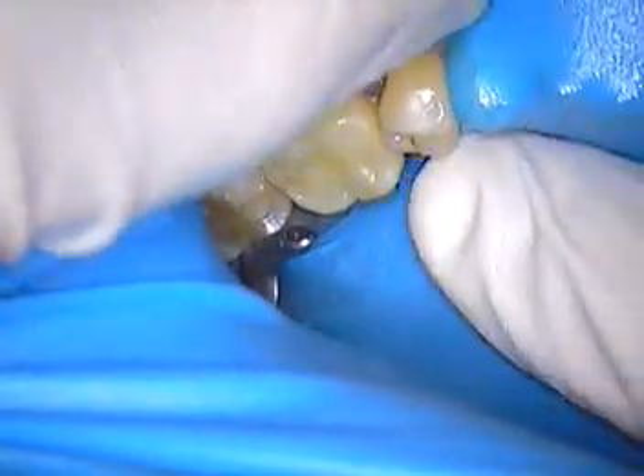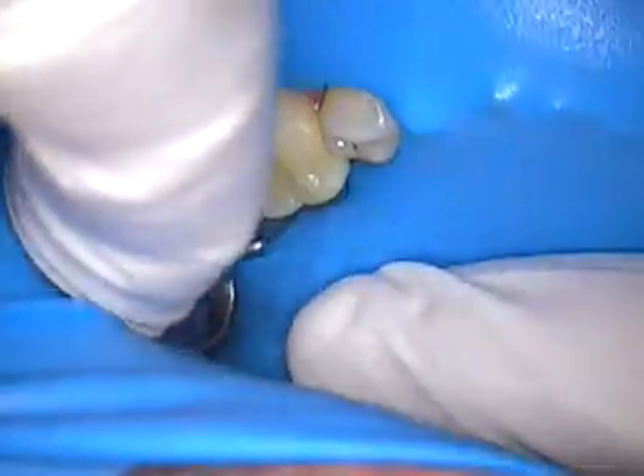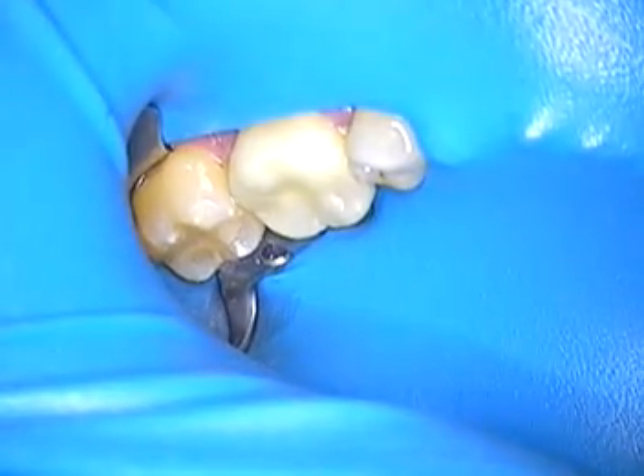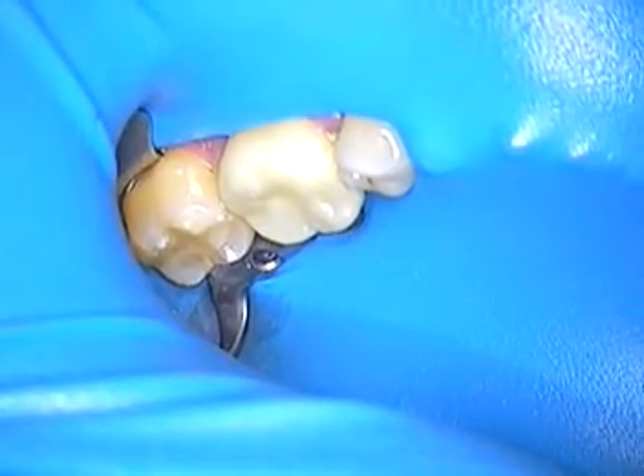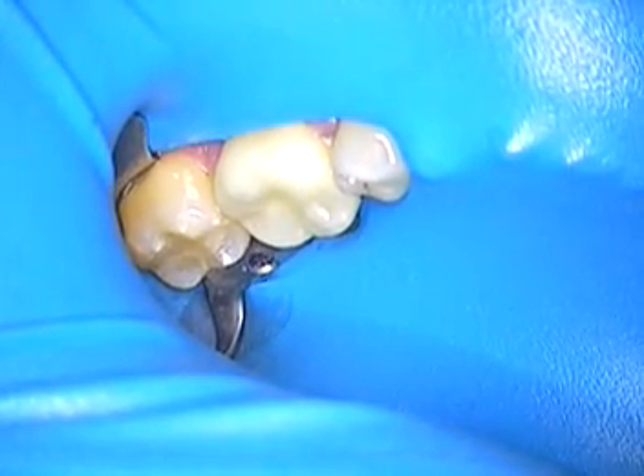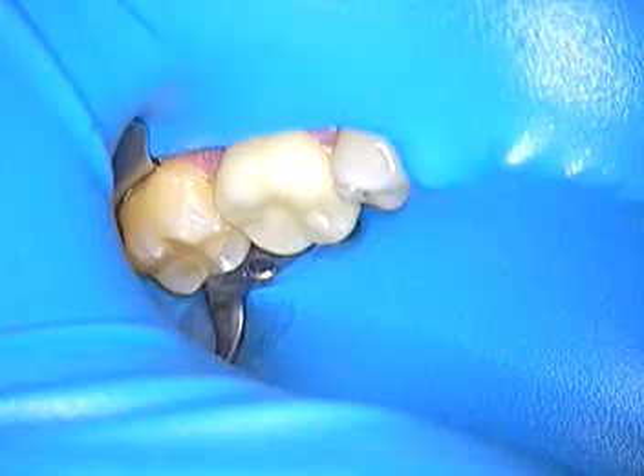So first things first, the clamp is on tooth number 18, and we're going to go right in. Our job is to remove the temporary on 19 today and gain access again to the old post and core. I don't have an x-ray to show you, but his case does have some obstacles, and I'll explain them as I go.